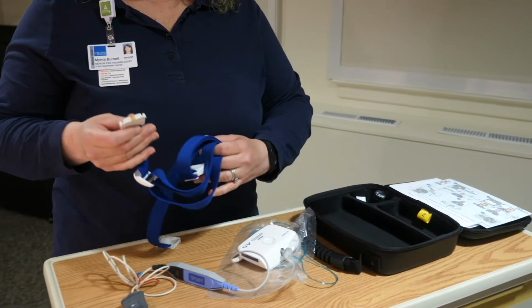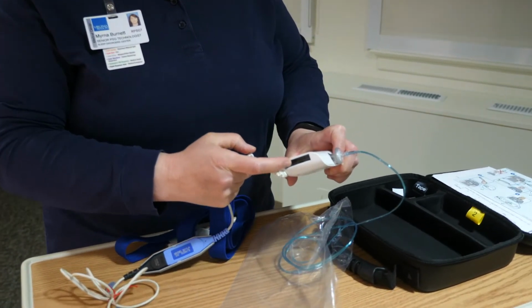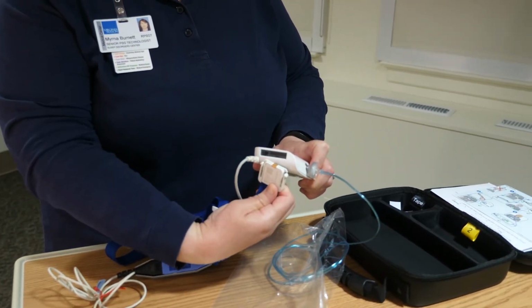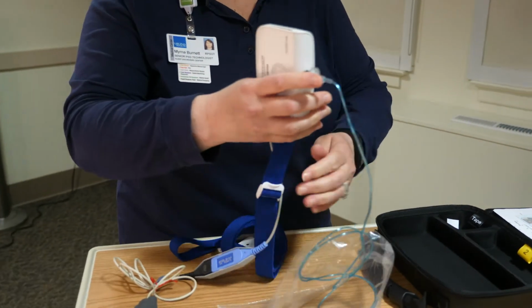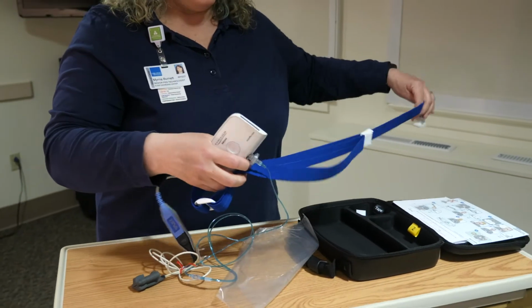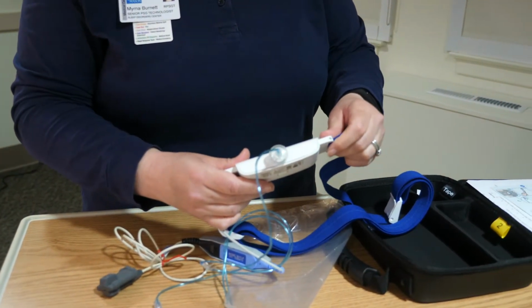The respiratory effort belt buckles have these metal plates on them. How it works is inside of where it plugs in, there are 2 little metal prongs sticking up. When it's plugged in, they come in contact with each other. You really want to make sure you hear that click, that it'll stay in there. When both sides are plugged in, it creates a circuit loop. And when that happens, that's what turns on the device.